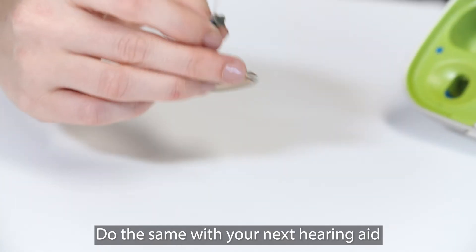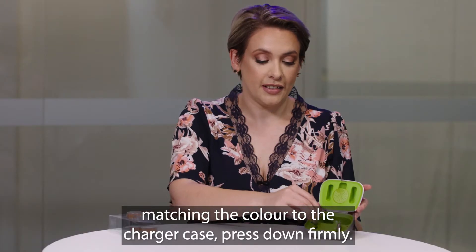Do the same with your next hearing aid, matching the colour to the charger case, and press down firmly.